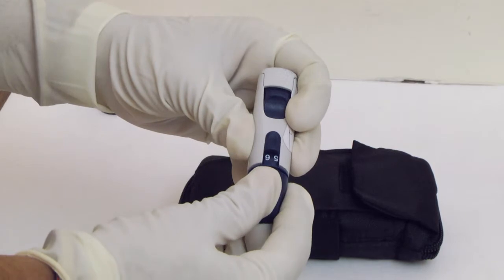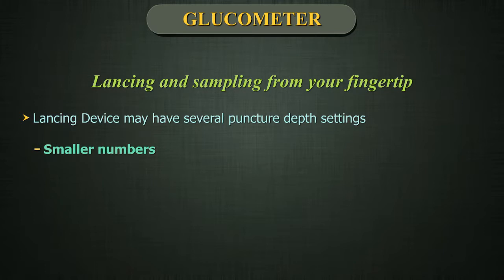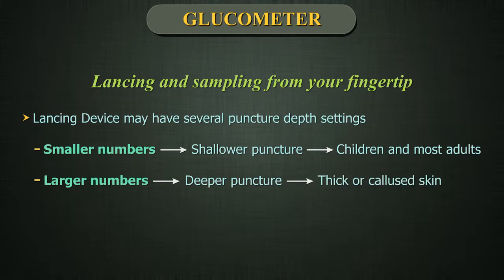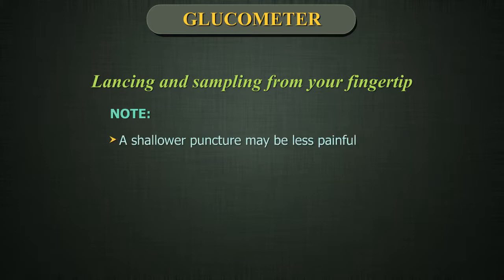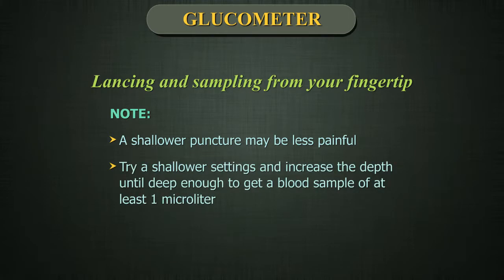Adjust the depth setting. The lancing device may have several puncture depth settings. The smaller numbers are for a shallower puncture and the larger numbers are for a deeper puncture. Shallower punctures work for children and most adults. Deeper punctures work well for people with thick or calloused skin. Twist the blue cap until the correct setting appears. A shallower puncture may be less painful. Try a shallower setting first and increase the depth until you find it deep enough to get a blood sample of at least one microlitre.